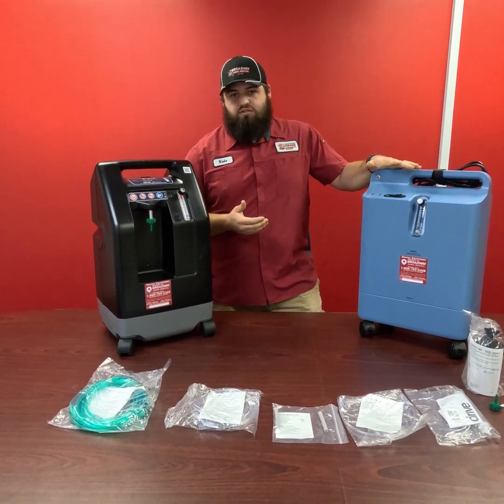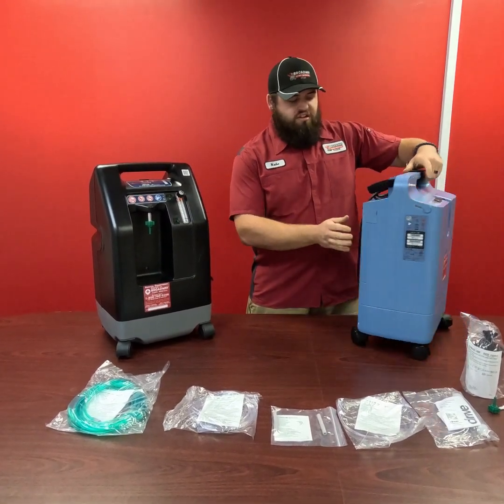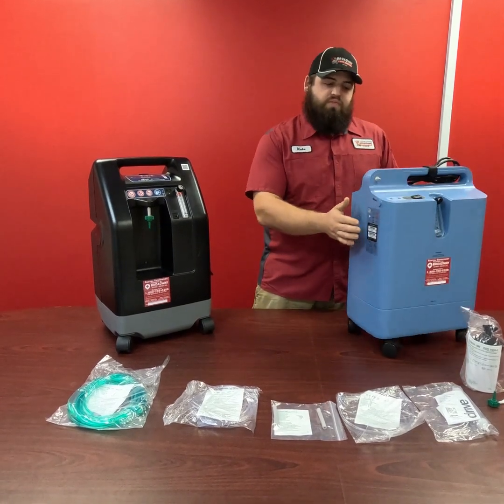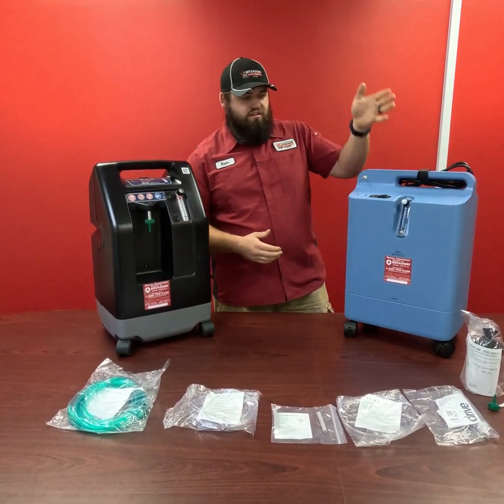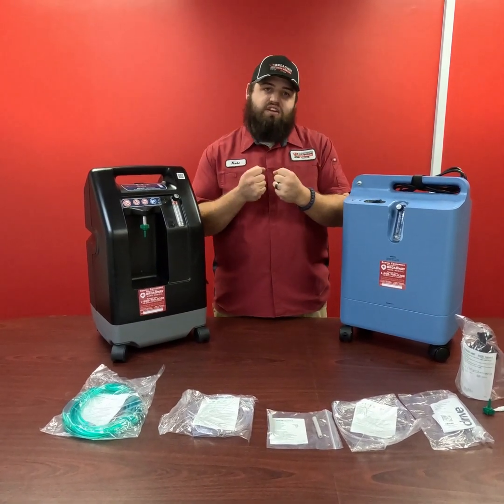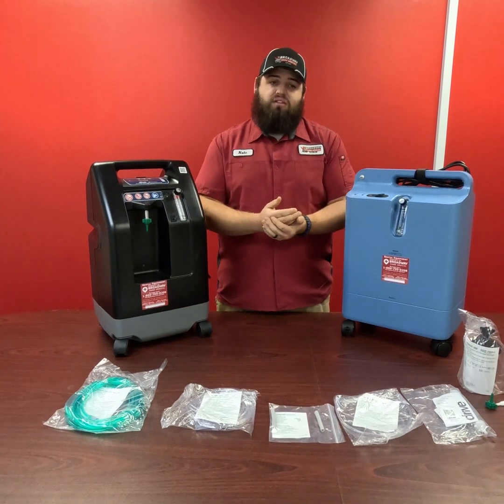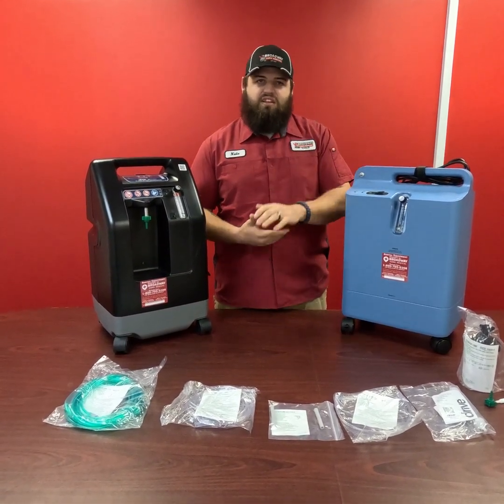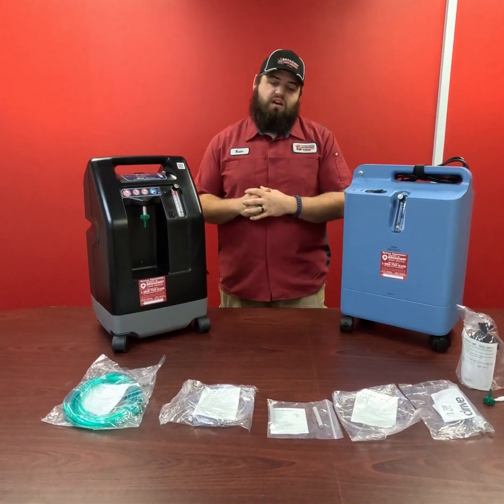These machines actually pull air in through the back. They do have big vents, and they'll circulate the air in and through what's called sieve beds, and it'll concentrate it down and push out typically anywhere from 87 to 93% oxygen.